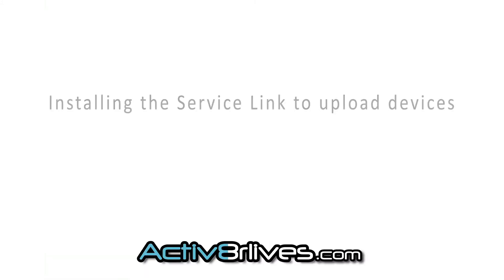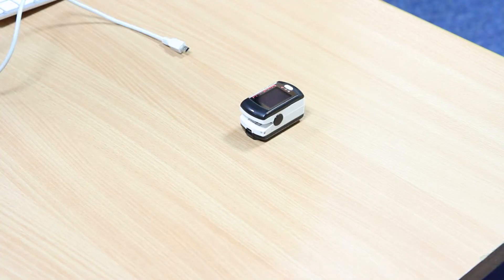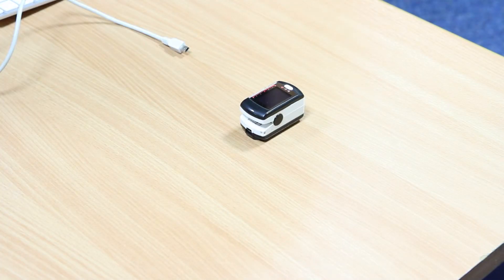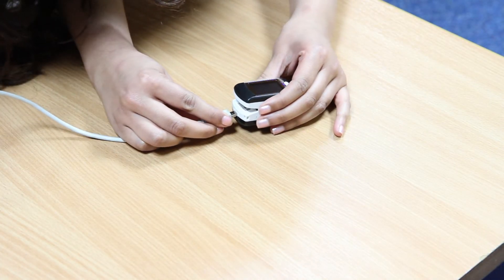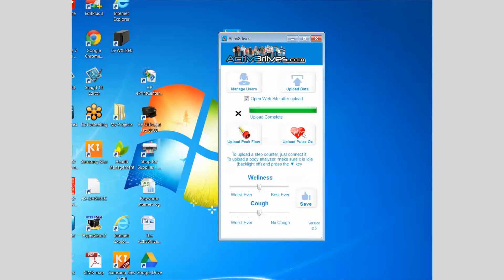Open the Activate Our Lives service link on the desktop. For installation, please see our other video. With the beige cable connecting your pulse oximeter and your computer, click on the pulse oximeter icon on the service link and wait for 2 minutes.